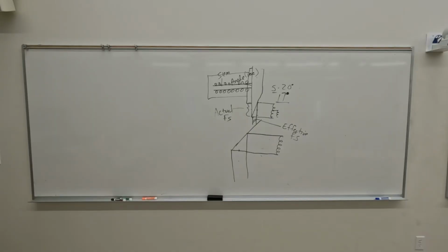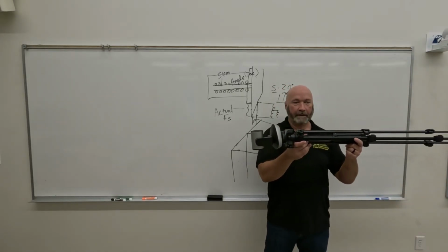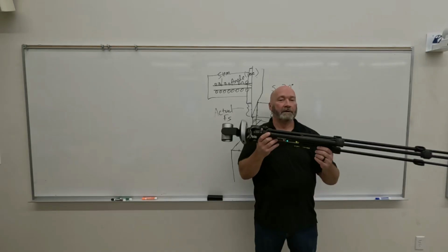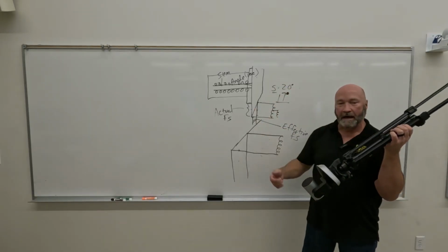All right, so your eyes are the anode. So how big is this? It's pretty big, right? I turn it like that, how big does it look? A little bit small. A lot smaller, right. So this is what we refer to as the line focus principle.